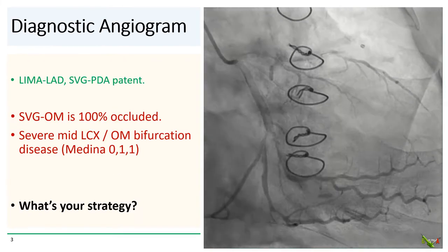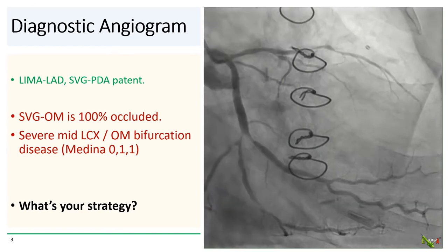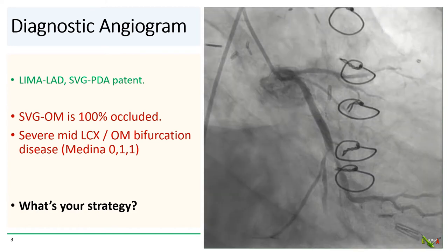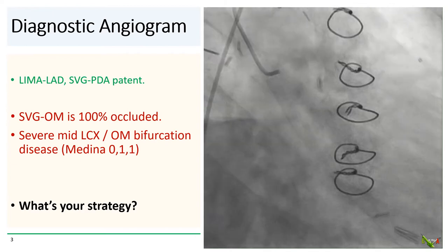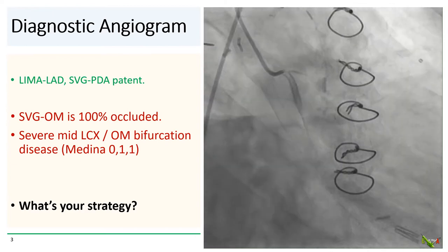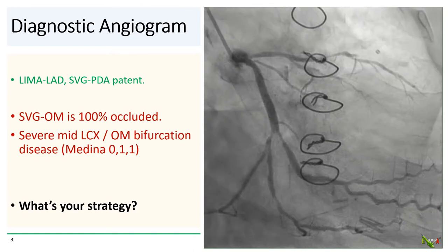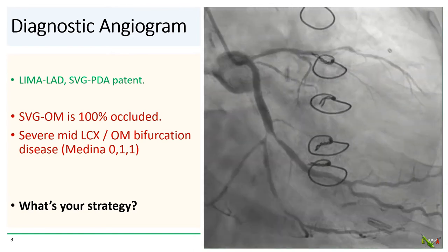On the diagnostic angiogram, the LIMA to the LAD and the vein graft to the PDA were both patent. The vein graft to the OM, however, was 100% occluded at its ostium. Here you see the native left circumflex system, which is severely diseased with a Medina 011 bifurcation disease in the mid-circumflex and OM bifurcation. There are also several severe stenoses in both distal limbs of the bifurcation and with more disease further distally as well.